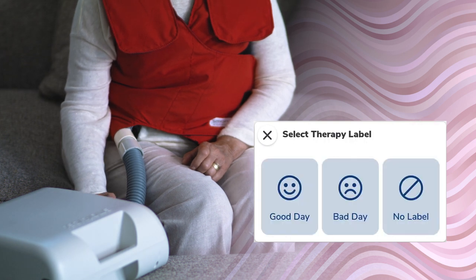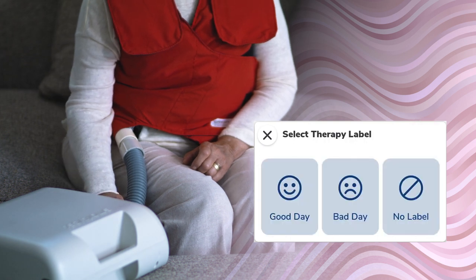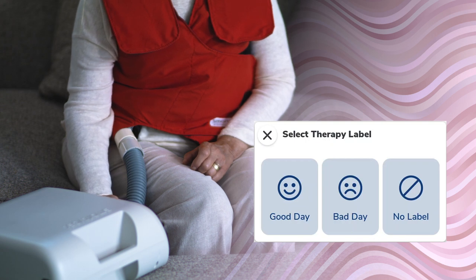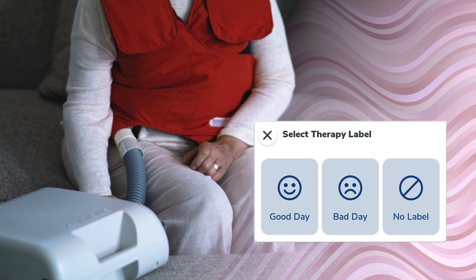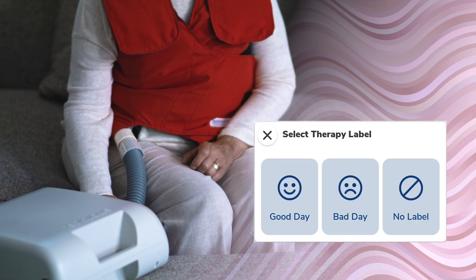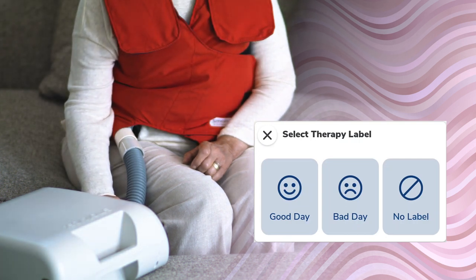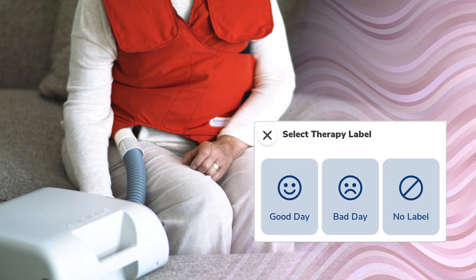Select a therapy label from the Good Day, Bad Day, or No Label selections to associate with this program therapy. A Good Day therapy is selected for days when a patient is feeling well and utilizing their SmartVest therapy for routine lung health therapy. A Bad Day therapy is for days when a patient is feeling more congested and needs to utilize a more robust therapy selection.